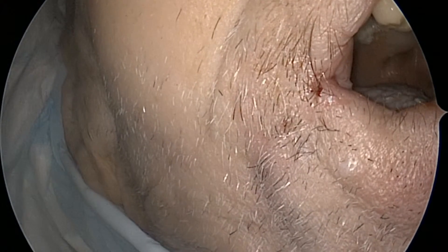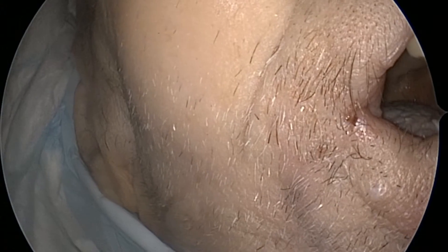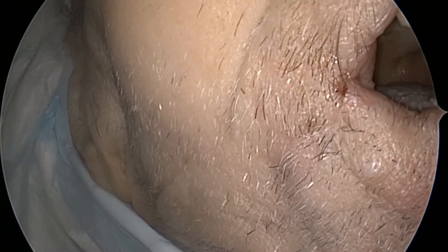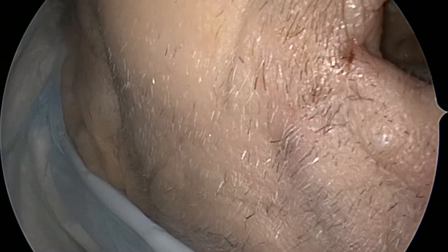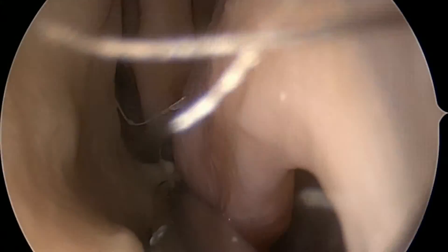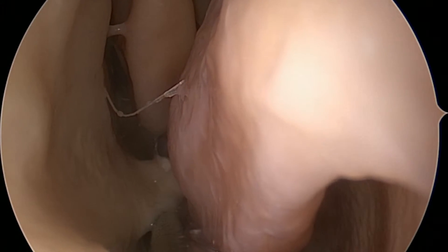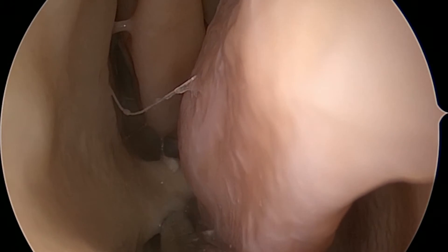The next thing we want to do is take a look at our ethmoid skull base, starting in the frontal sinus and working posteriorly. We see the slope and the height. We also want to look at the depth of the olfactory grooves. I don't look at these in terms of Keros classification, but I do look at the depth and the symmetry of the ethmoid skull base, as we're going to be moving to the next side just a little bit later within this procedure. We also want to look along the nasal septum — are there any obstructions? We can see there's a spur along the vomer to the left-hand side, which sometimes can come into play.